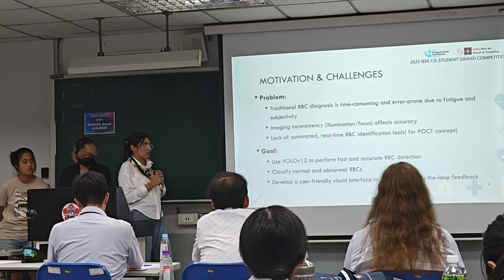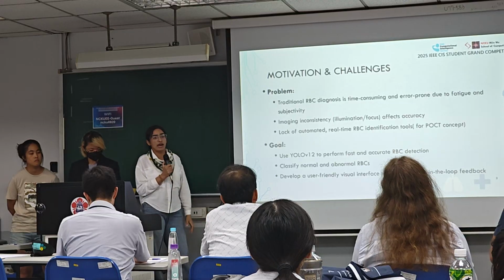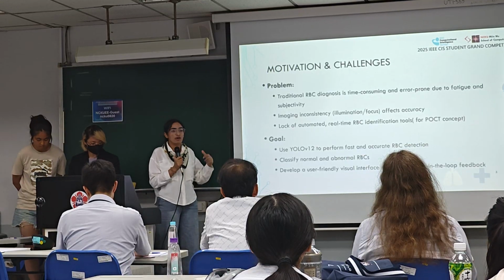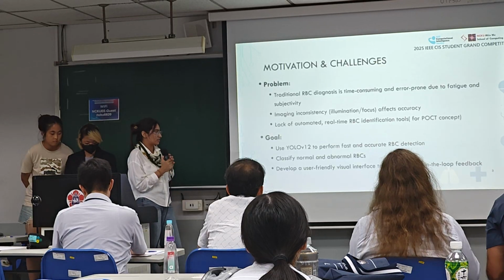The software we trained for this module is YOLO V12, and it is more accurate and gives fast and quick results, which also supports our idea of real-time evaluation, because it gives more accurate results and analyzes images very quickly.